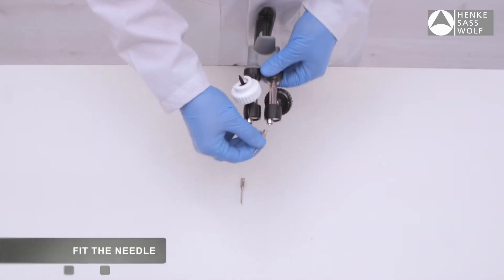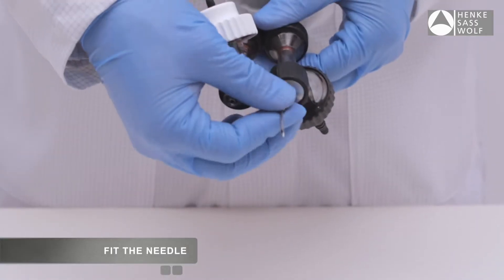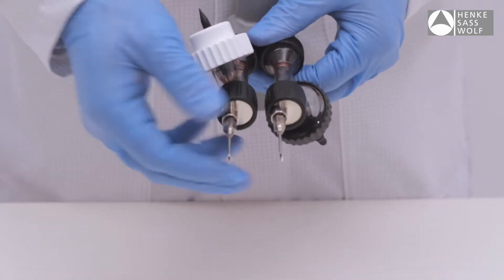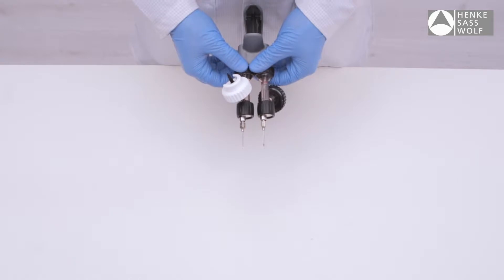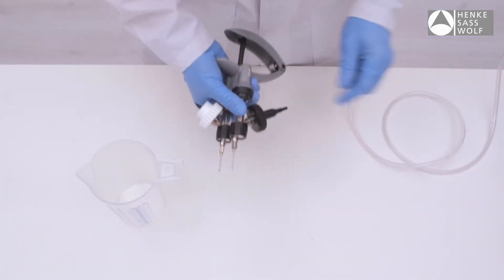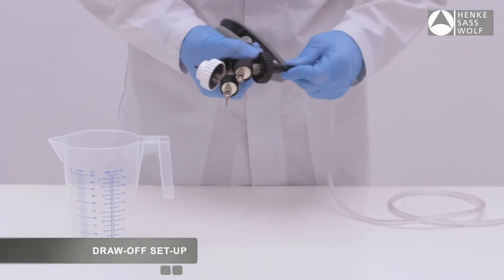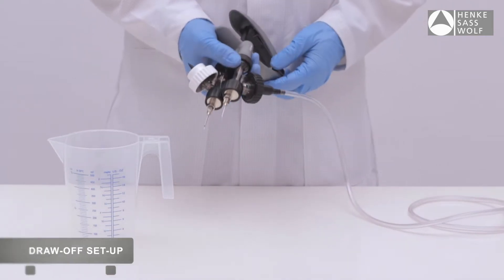Insert the needles onto the luer lock fitting and secure the needles clockwise. Attach the tubing to the spigot collar and push the tube on the spigot as much as possible to ensure a tight connection.